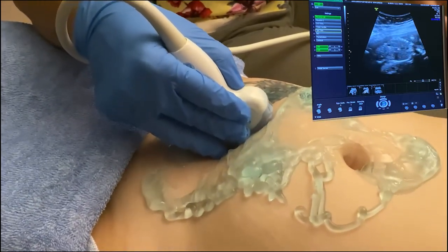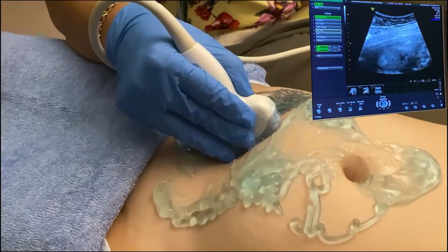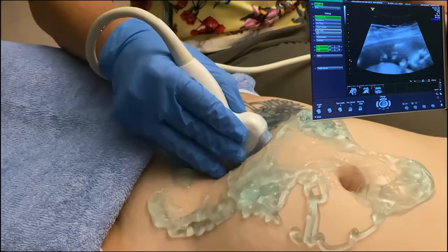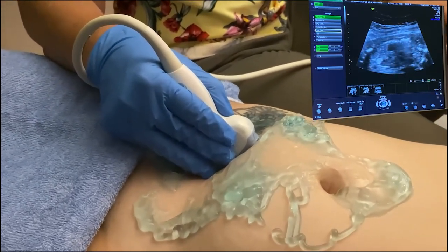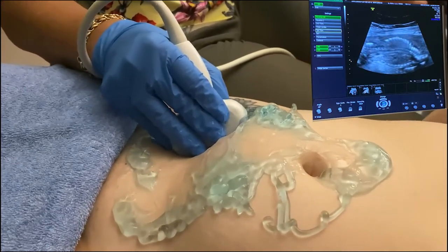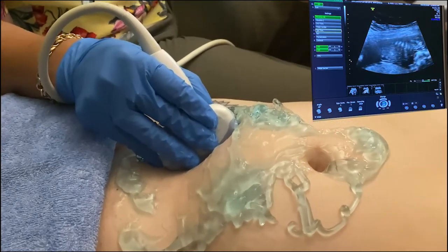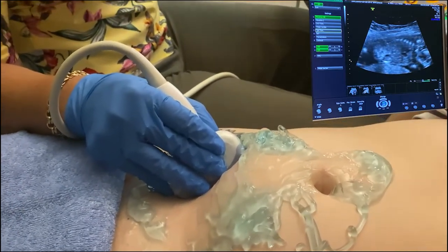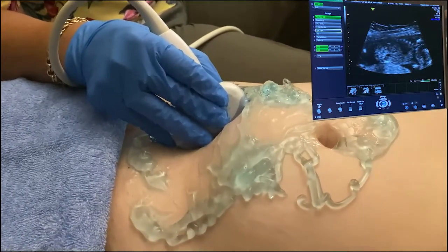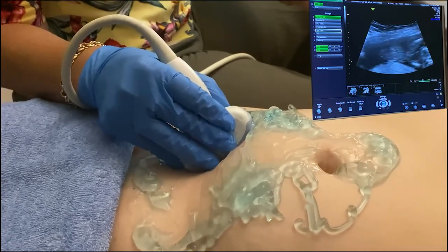We can further evaluate the diaphragm as it goes across the liver. We want to make sure all organs are in their proper compartments to rule out things like diaphragmatic hernias. We want the bowel to be slightly echogenic, but not more echogenic than bone. And we can turn it down, and we can see here that it's not. They're about equal. Actually, the bowel is a little less echogenic than the bone, so that's normal.